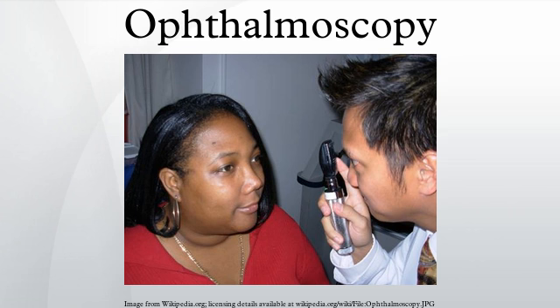The direct ophthalmoscope is an instrument about the size of a small flashlight with several lenses that can magnify up to about 15 times. This type of ophthalmoscope is most commonly used during a routine physical examination.